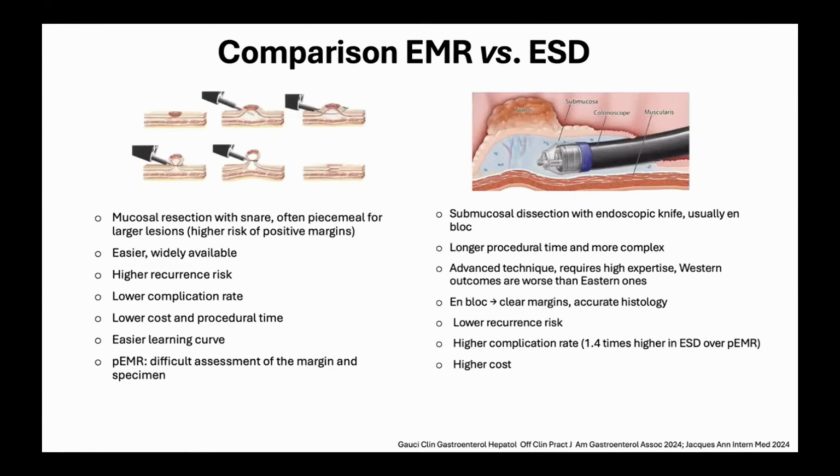If you do a piecemeal EMR, intuitively, you don't provide the pathologist the full specimen. So you end up giving them small parts of the specimen, and the pathologist won't be able to give a full assessment. On the opposite, with ESD, you can give the full specimen, and the assessment is thorough. The histopathologist can describe the margins, the lesions, the cells, the budding when there is budding, the lymphovascular invasion, etc., in detail.